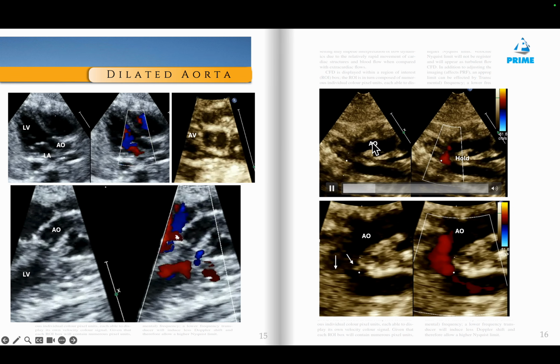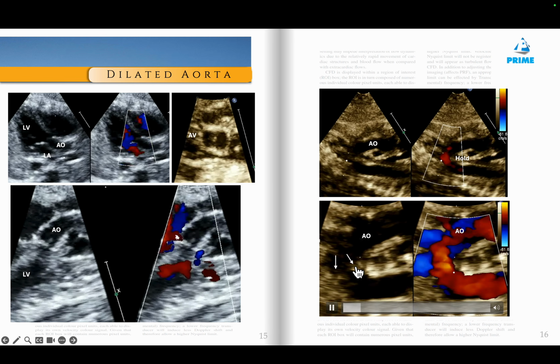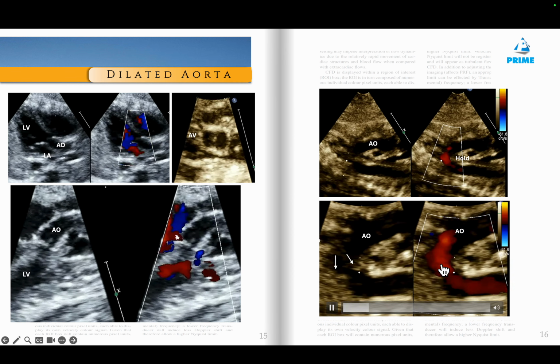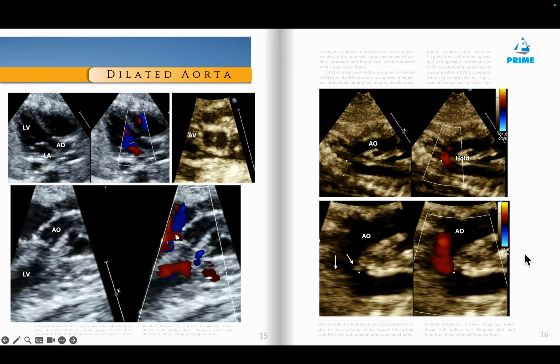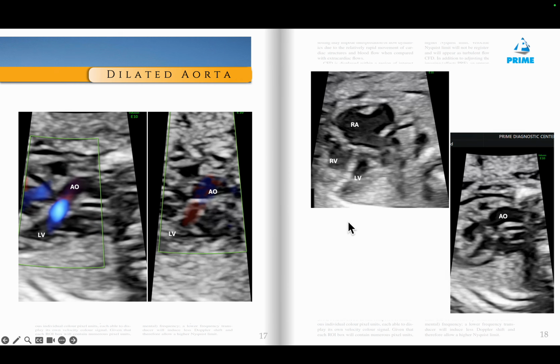The same patient, because you must remember, patients with the bicuspid aortic valve have a common association with coarctation of aorta, and this patient had coarctation of aorta. You can see these ridges here, and you can see the diastolic hold of the blood, which are kind of characteristic of the coarctation of aorta.